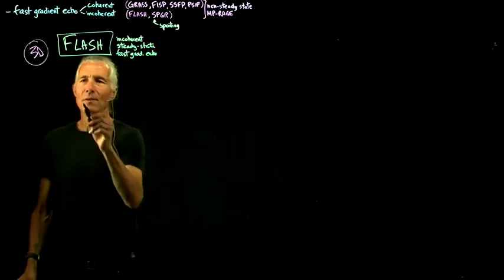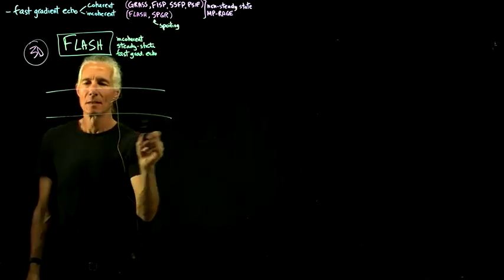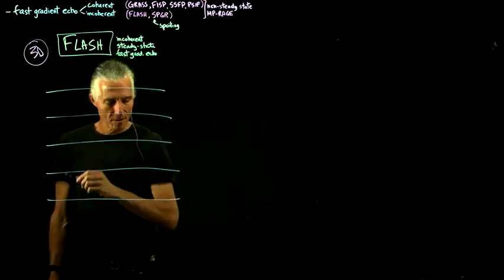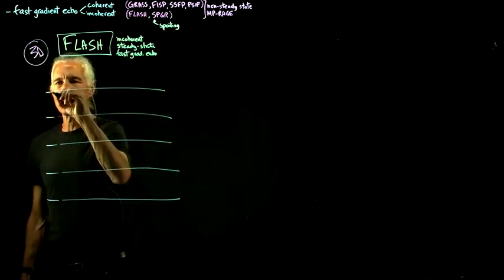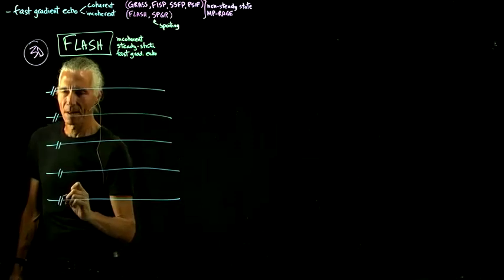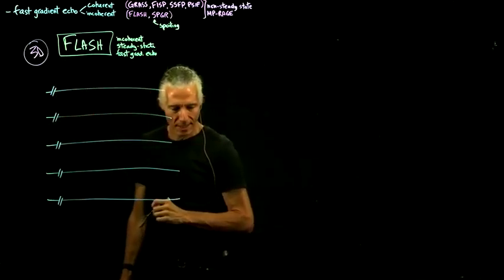So this one is quite simple. Again, we're assuming that we're in the steady state, so we already have done this a whole bunch. It takes like 10 or 20 pulses before it gets to the steady state.